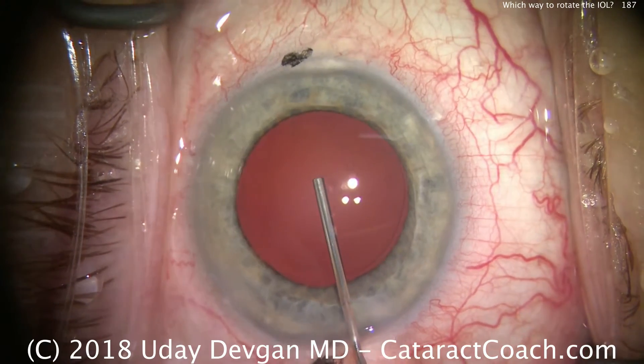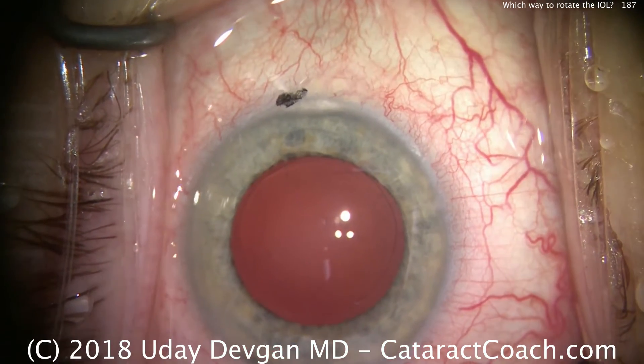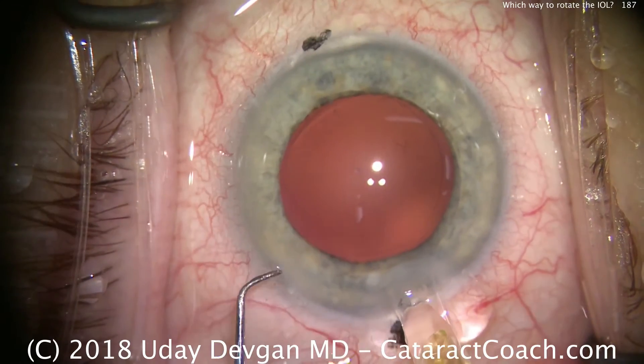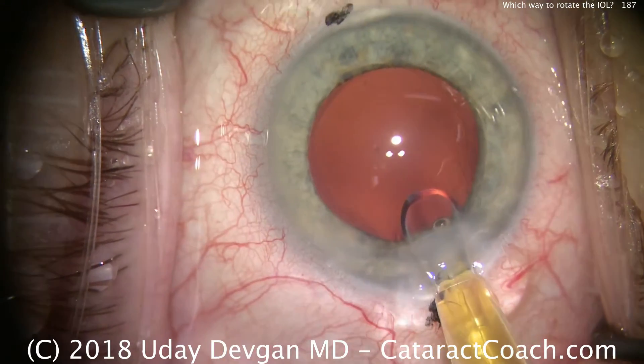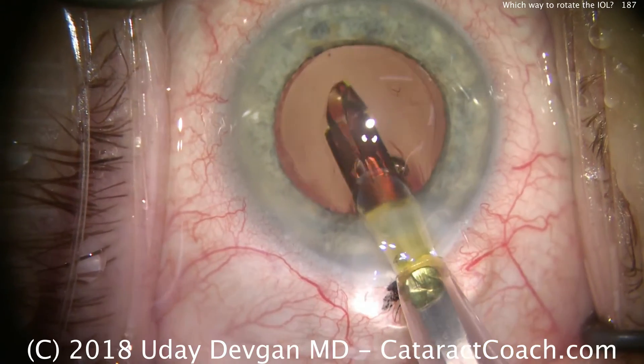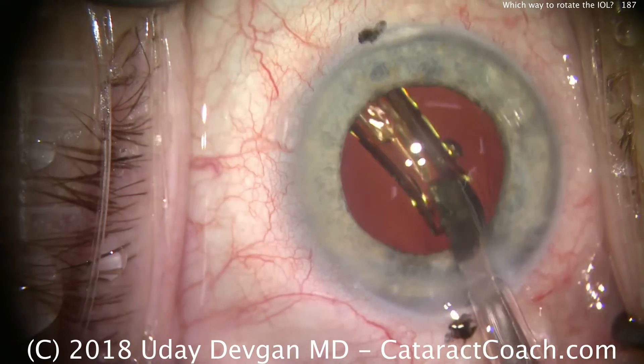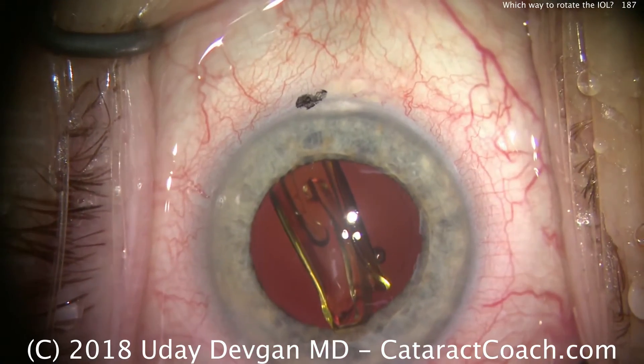Here's a routine case with a toric lens, the capsular bag being inflated with cohesive viscoelastic. And now when we put the lens in the eye, it's rolled up in its compact state. In this state, where the two haptics are on top of the optic, it's very easy to rotate the lens in either direction.